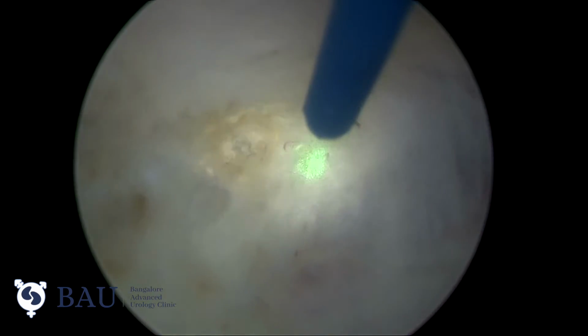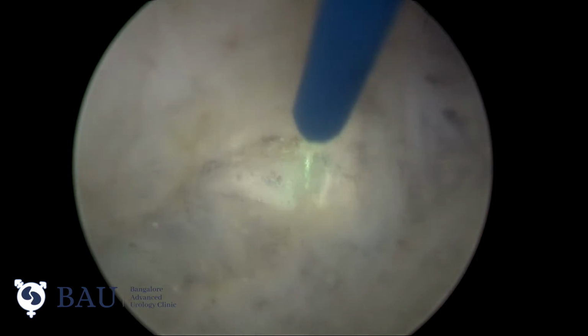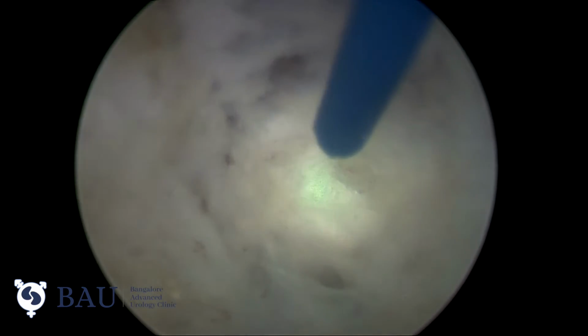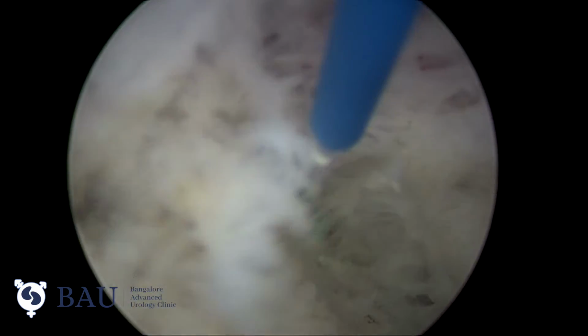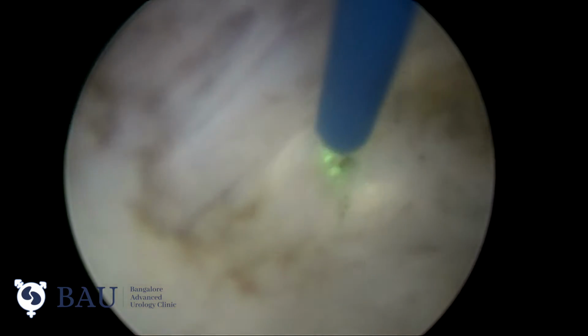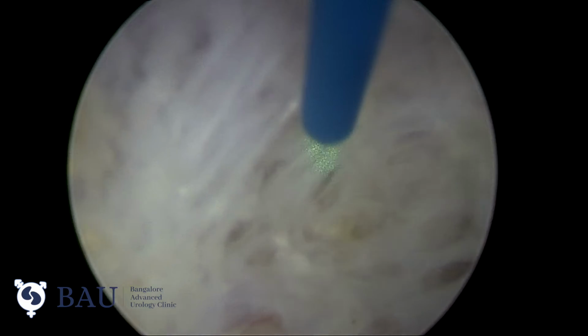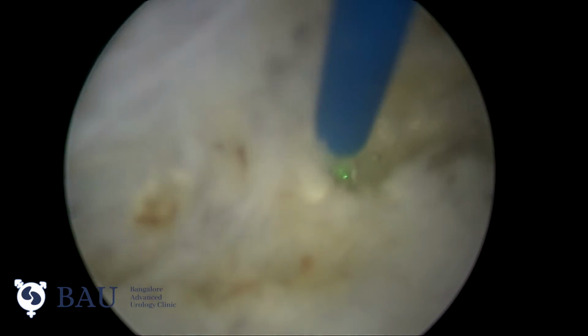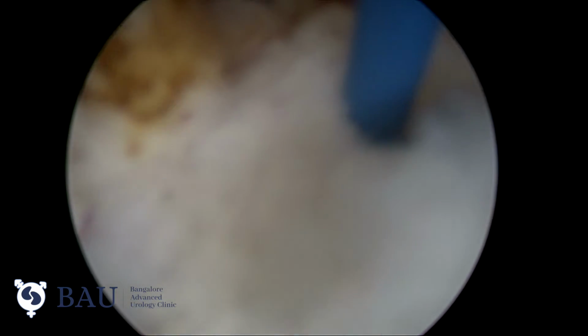So here we have already created a plane and keep dissecting until we reach the bladder neck laterally. If we get any confusion in the plane or where the plane is not good, then we have to move towards the cleaner zone, and from there we should start dissecting towards the confused area.